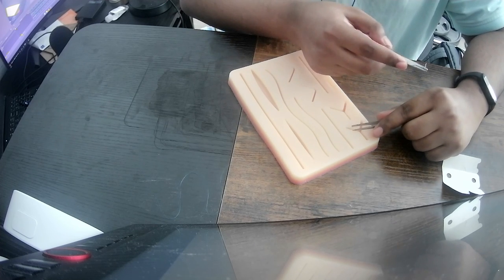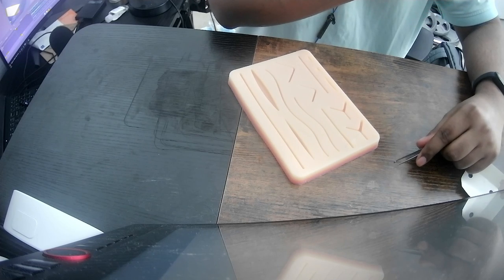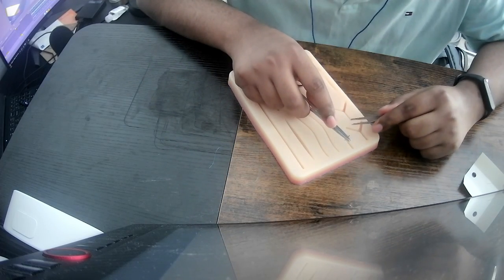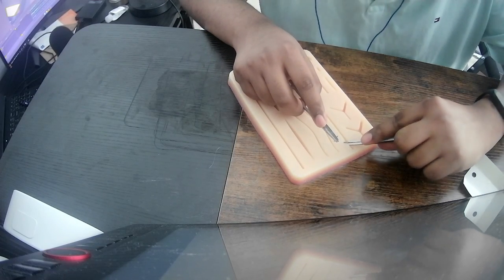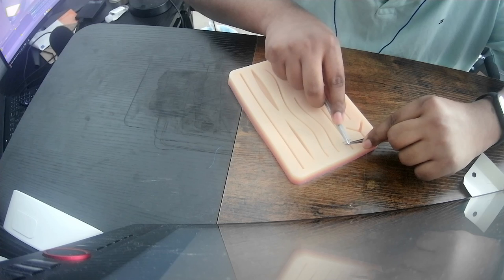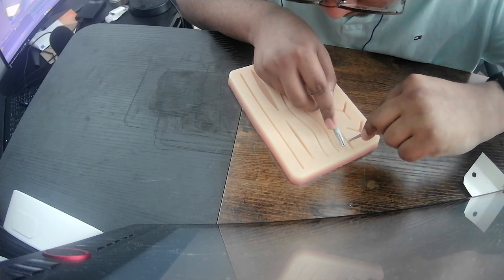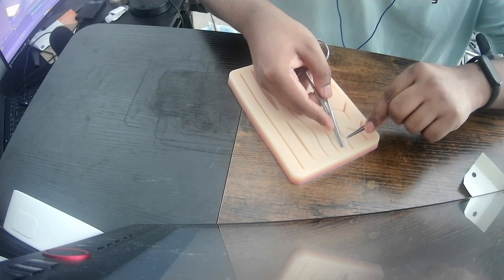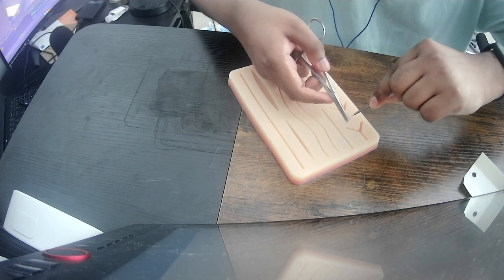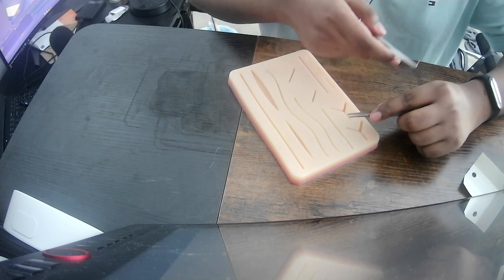Okay, so yeah, I'm basically pulling the suture through the wound. Gotta be careful not to stab myself as I do that or point it at some other colleague of mine. Okay, let's try that again. So I'm pulling, let's try to get a better angle this time. Relatively close. Okay, and then on this side. Let me try doing it in two goes. There are different ways of doing it apparently. So there's one. Okay, locked. So I'm driving it.